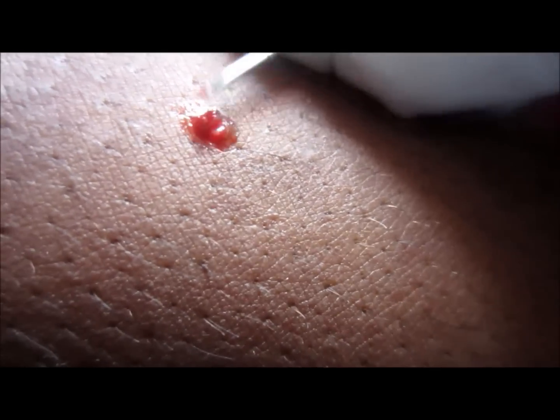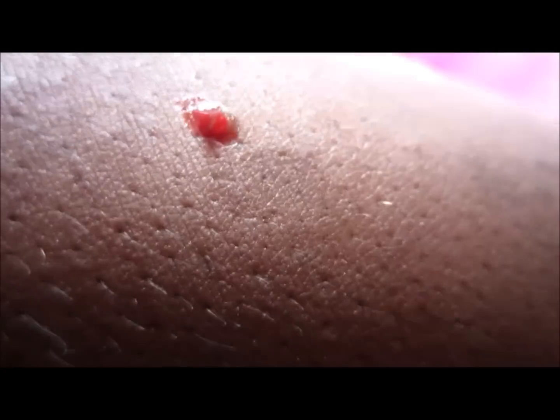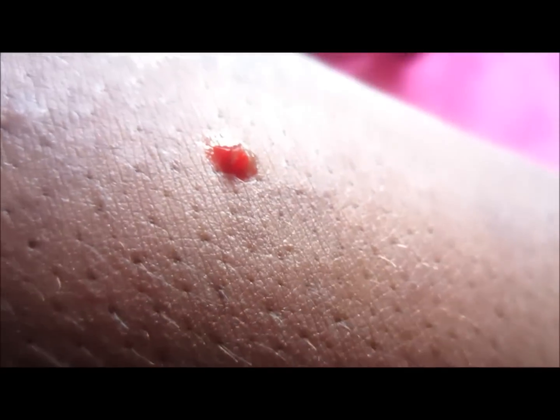You need to remove the Henderson-Paterson body, also called the molluscum body, which lies in the center of these papules.